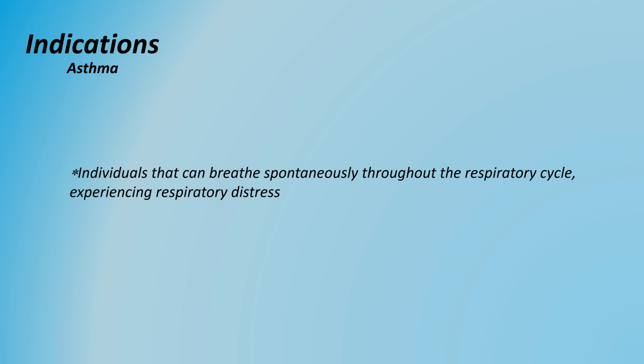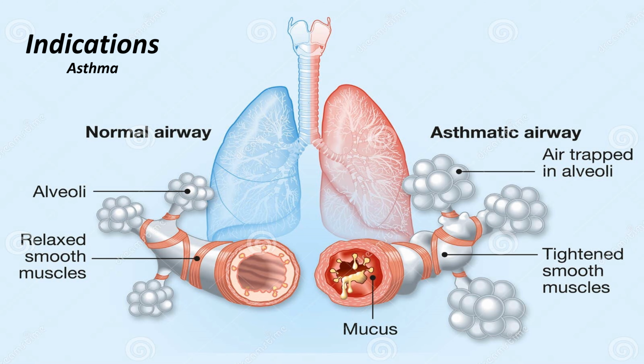But specifically, the uses of CPAP are many. Starting with the most obvious, CPAP is definitely indicated for use with asthma patients. Some of you may be familiar with this graphic illustrating what we're dealing with in an acute asthma attack. We have air trapped in the alveoli, narrowing of the airways, restricting airflow in, and making it difficult to fully expire air from the alveoli. So with this in mind, what is CPAP going to do for these asthmatic patients?